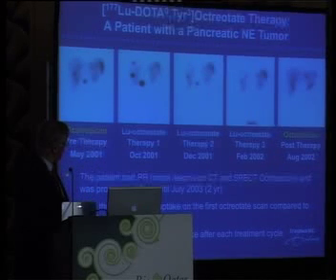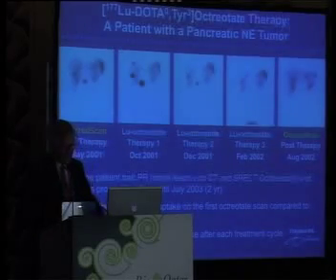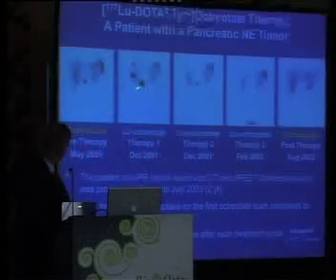The day after, the patients are being scanned because they are radioactive, so there's no need to do an extra injection, and you can get very nice scans. This is an example. This is a planar octreoscan, the normal octreoscan out of our project, and worldwide now available. You see here the first scan the day after the treatment of this patient.